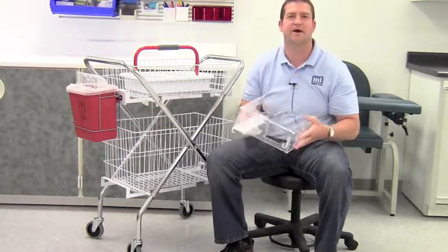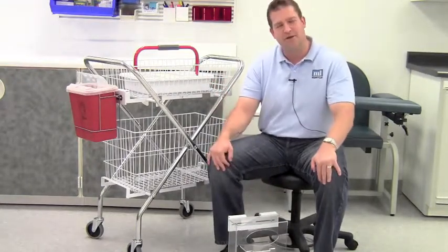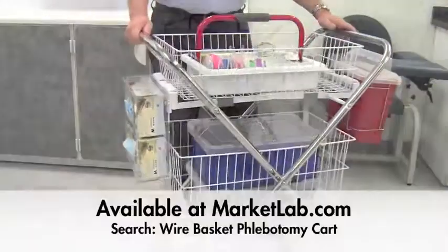It ships complete and ready to use. All of these components are also available separately so you can create the cart you want. That's the Deluxe Wire Basket Phlebotomy Cart, another unique solution from Market Lab.